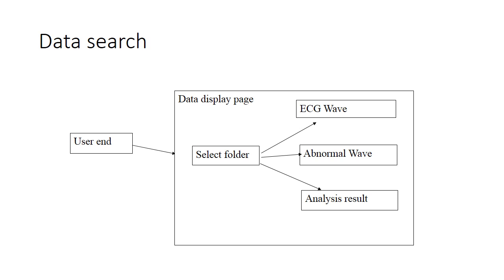Analysis results displays the stored file that the user selected. After a little research and analysis, the software will display everything it found at initial application. The user can log in to the account, select the corresponding folder, and then look at the corresponding information they need.